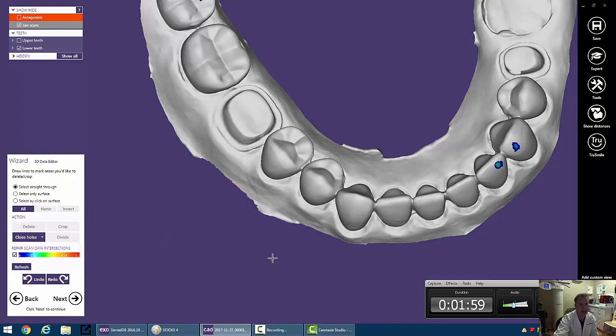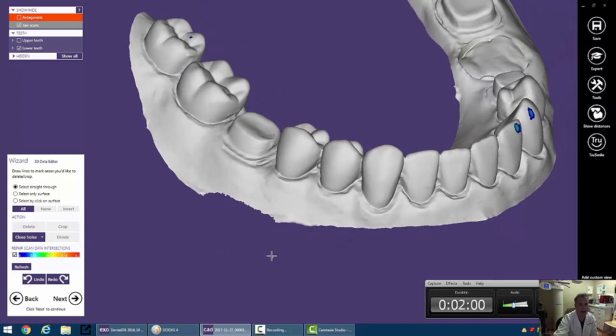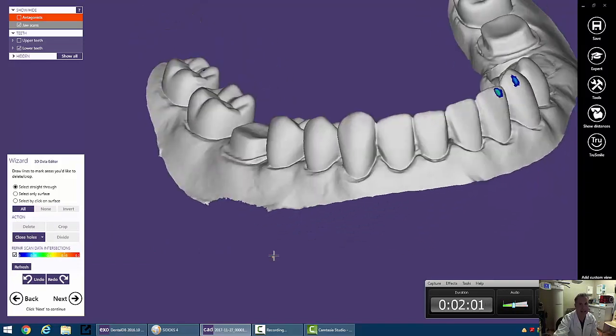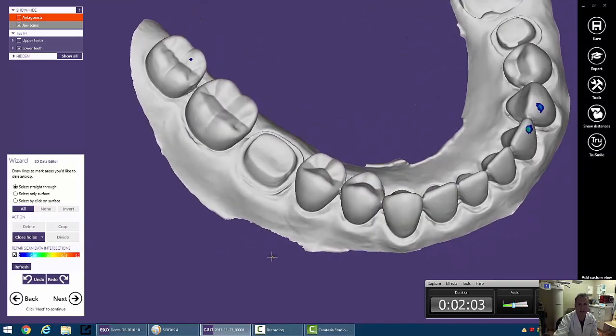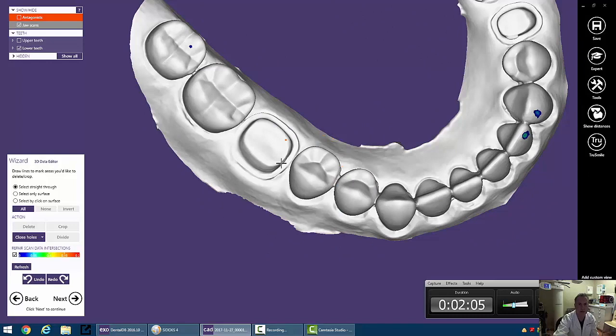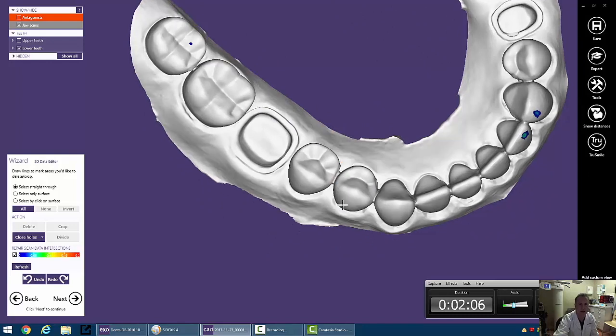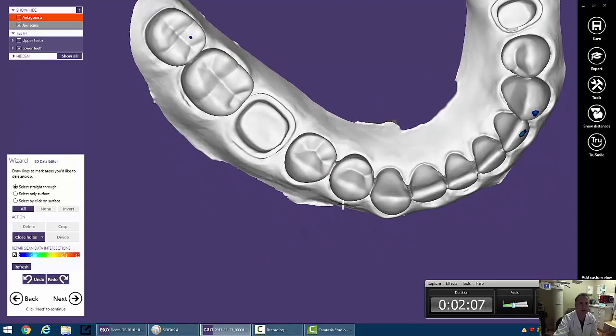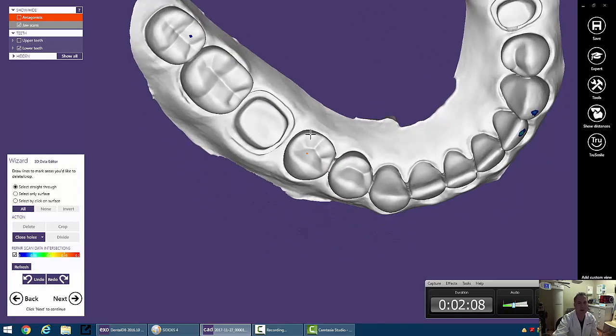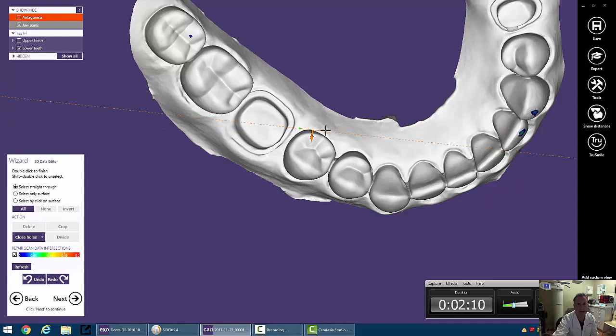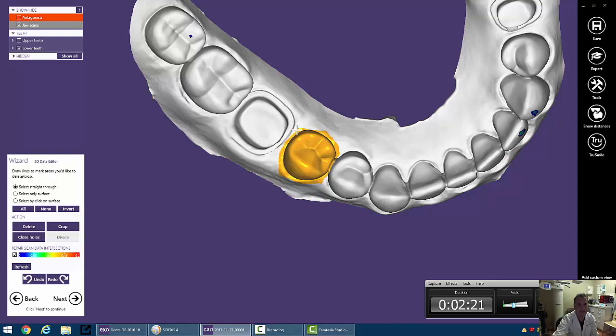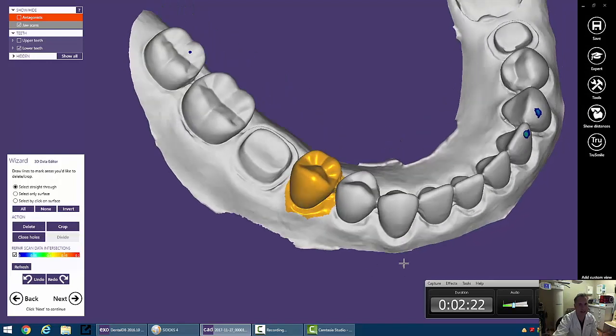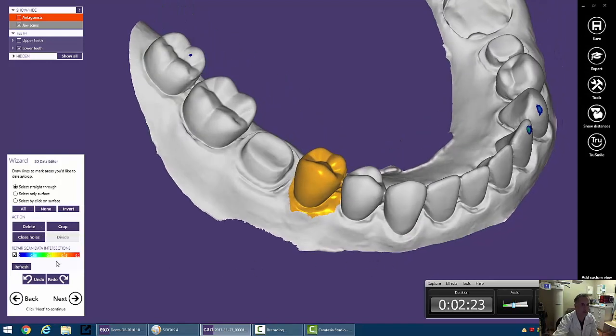But let's say we wanted to do an immediate implant on number 29 over here. Well, we can do the same thing. We can go ahead and single-click and single-click around this tooth, and very carefully, so that we don't interfere with the contact of the adjacent tooth, come back around here and double-click. That's going to select this tooth. We can go ahead and Delete that.